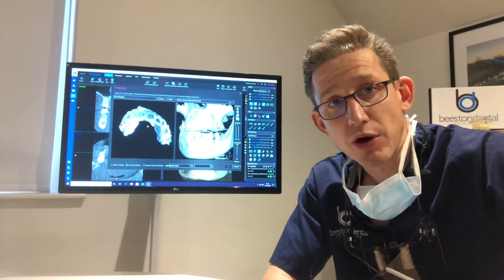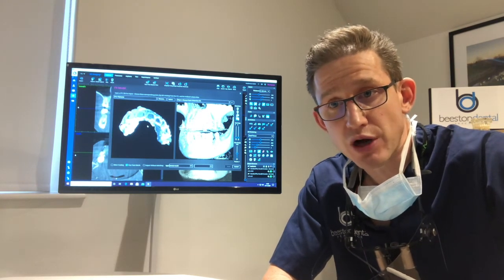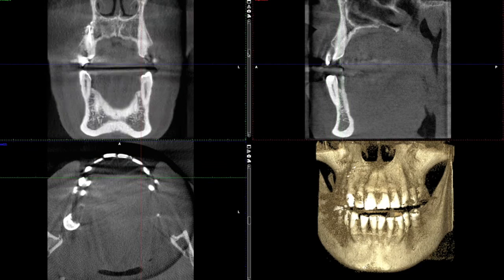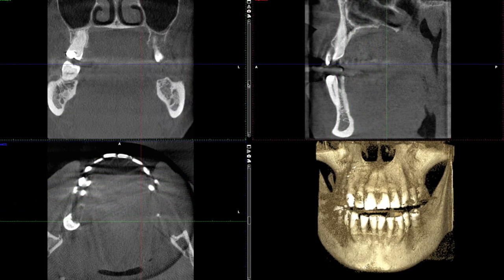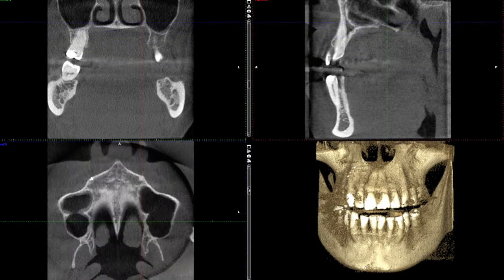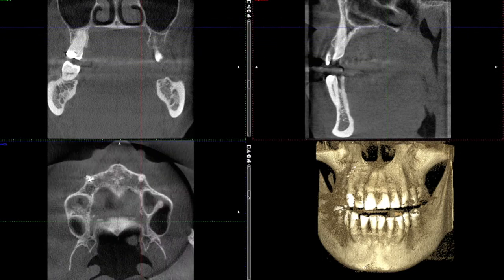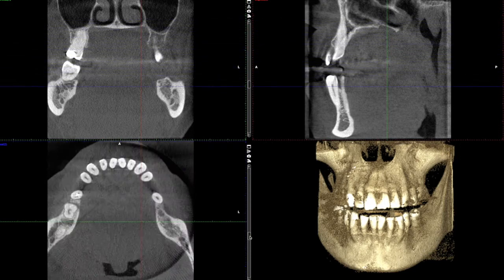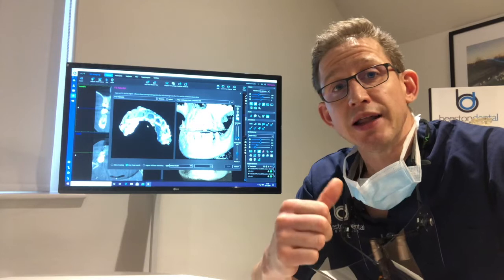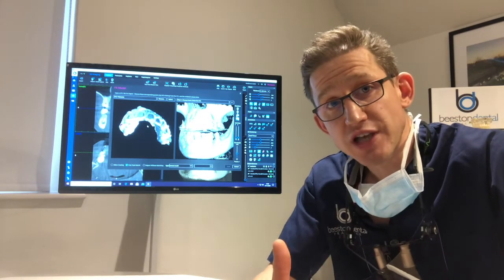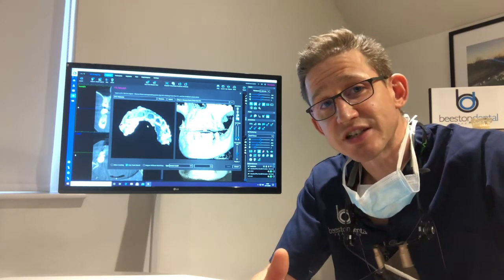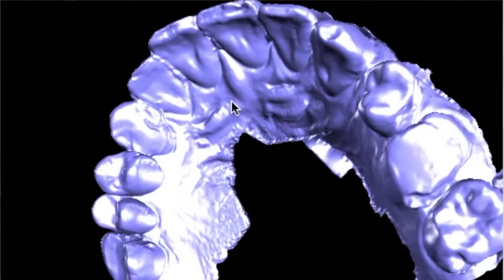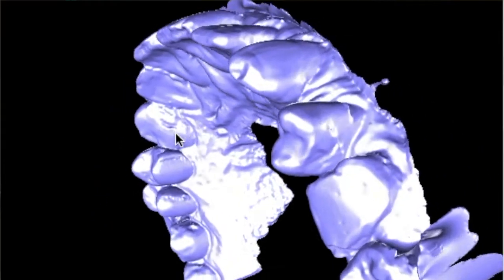Now why do we need both scans? Well, the CT scan — the 3D x-ray of your jaw — shows us where the bone volume is, where the bone is under the gums. The 3D surface scan, or the intraoral scan, gives us an accurate representation of where your teeth are.